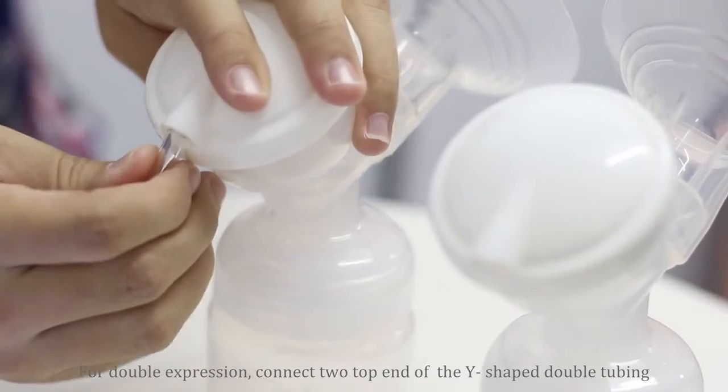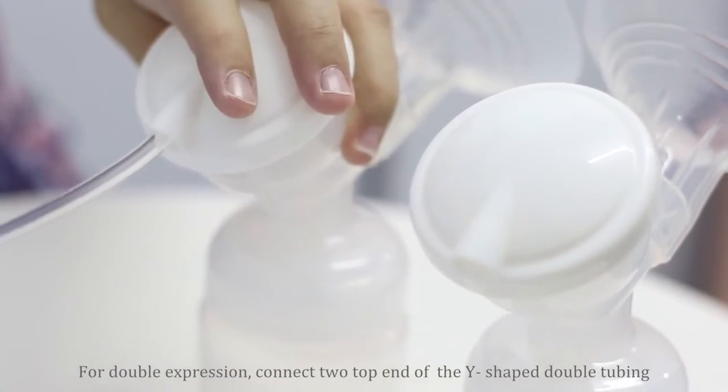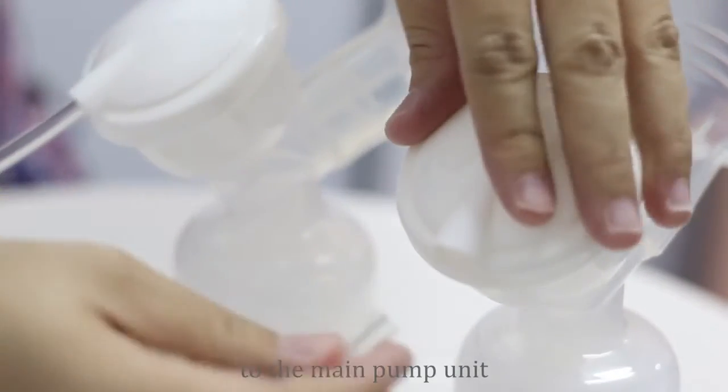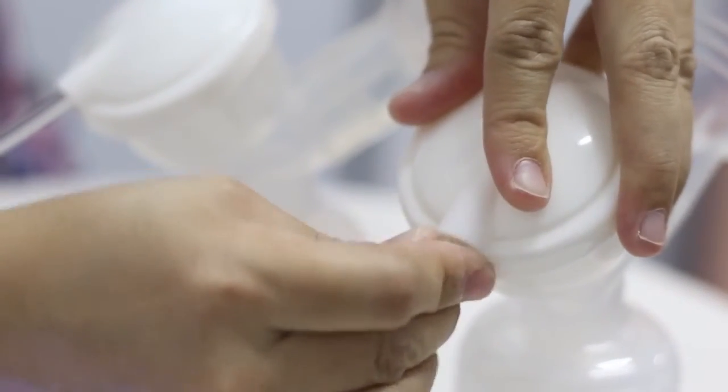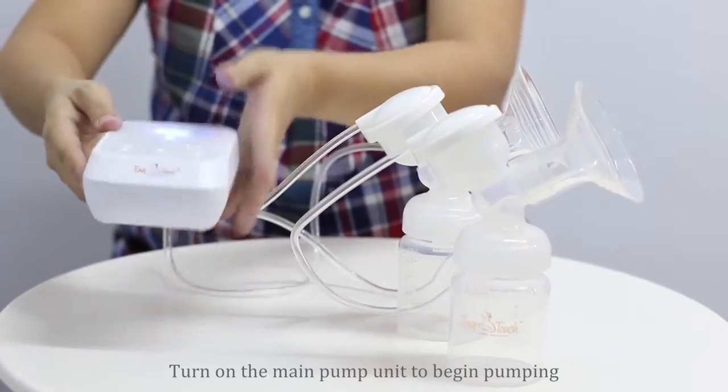Connect the top end of the Y-shaped double tubing to the main pump unit. Turn on the main pump unit and begin pumping.